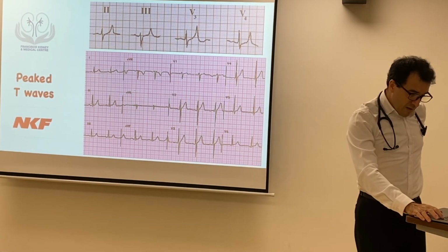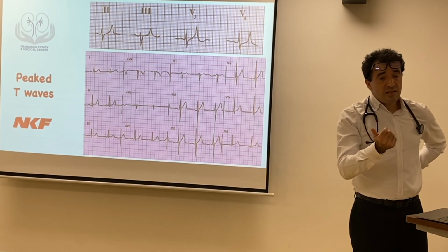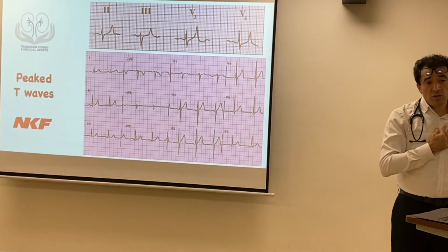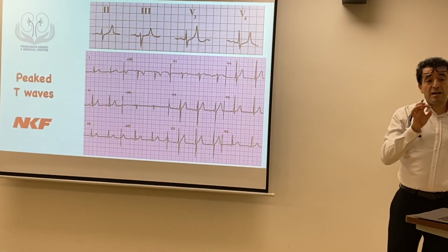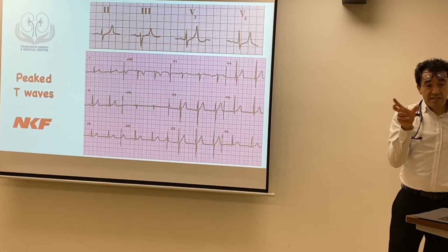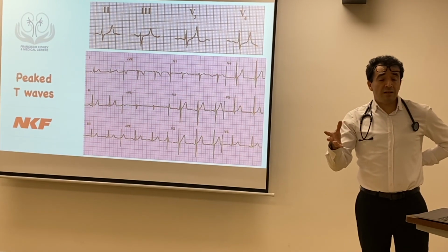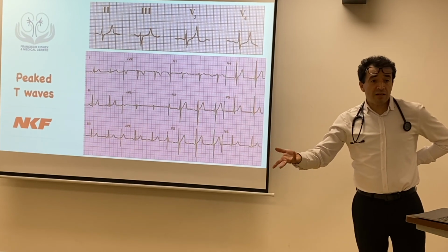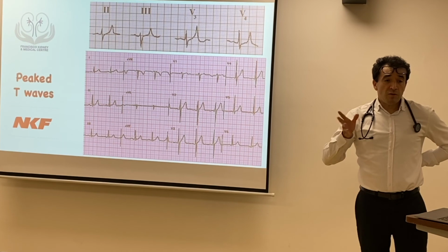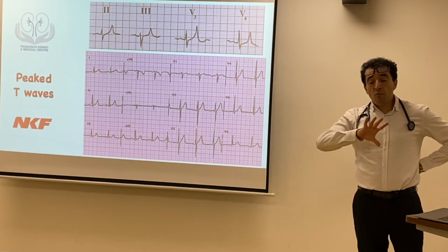Unfortunately, atrial flutter is so characteristic, but atrial fibrillation is sometimes difficult. It's difficult to identify when there is aberrant conduction and wide QRS complexes, because then you don't know if it is atrial fibrillation or some degree of ventricular tachycardia, etc. So it requires more experience. In that case, it's more confusing.